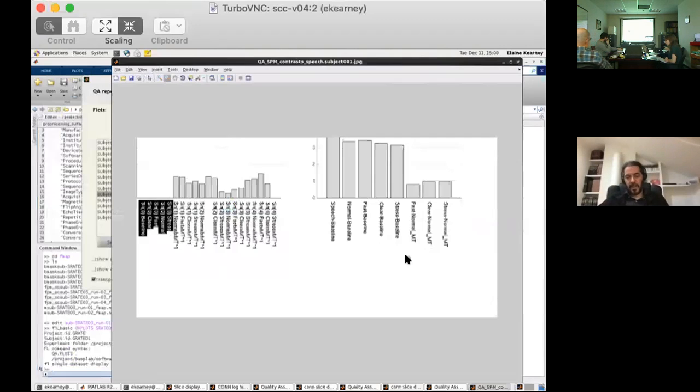And then the contrast that we do care about typically in the experiments are the ones that are comparing the different conditions. So you can design the experiment better, try to improve the ones on the right and decrease the ones on the left, basically. So this has been the issue all along, is that we just don't see anything when we do these within speech condition contrasts. And in this case, we're including the duration as a covariate, so I will have to look at why that is happening.